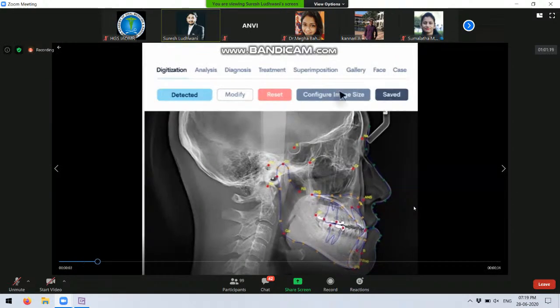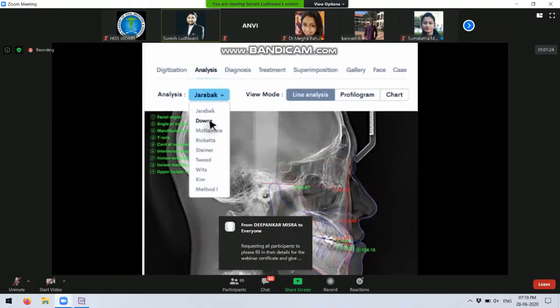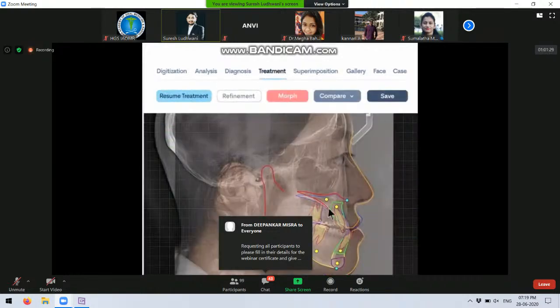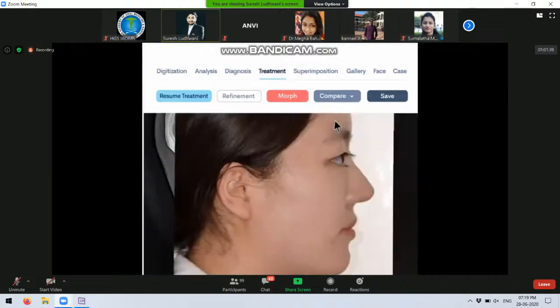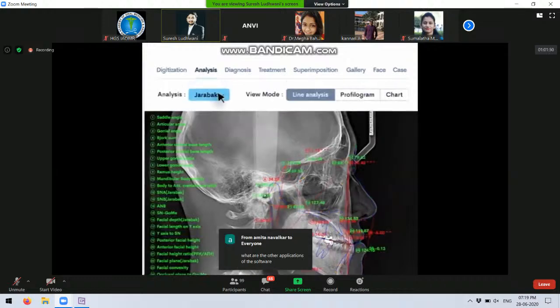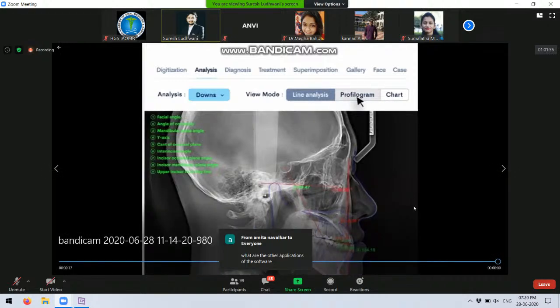You can see I've just uploaded. The software showed me all landmarks. I've selected my analysis. I've approved my analysis. I can select the photo. I can do the morphing. So you can say this is partially AI based. Partially it does need your intervention, and partially it is done by the software itself.